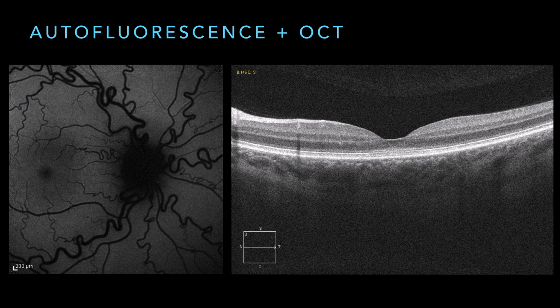And so anyway, the patient on your left is a patient with vascular tortuosity. I thought this is just a beautiful image. And the patient on the right is somebody who came in to see me this week with a little bit of nyctalopia, some hemeralopia, a 28-year-old female who had a perfectly normal fundus exam, but she's got these findings on her OCT, which you can see. Her ELM is a little bit grayed right in the center, and her ellipsoid zone is a little bit fuzzed as well. And so she's getting a workup done.